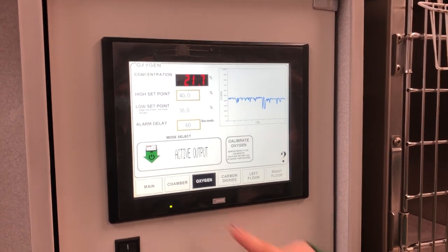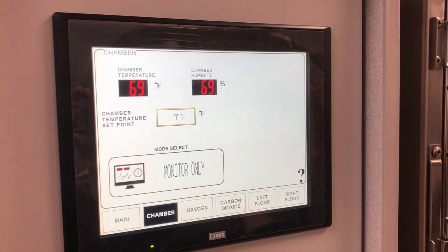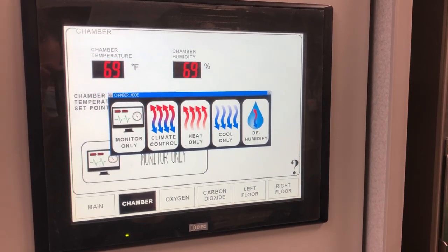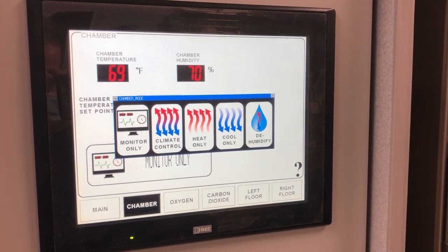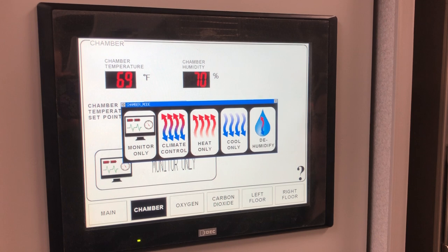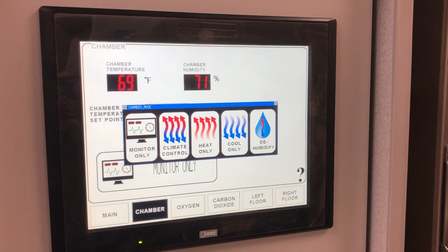Next, set up the chamber itself. Select chamber and set the temperature you would like — for example, 71 degrees — and it will automatically reach that. Select monitor only; there are four different options. Climate control will heat and cool the unit to maintain that temperature. Heat will only apply heat. Cool will only cool it down. Dehumidify — if the humidity is too high in the chamber, you have to select dehumidify manually; it will not do that automatically, and you also have to shut it off manually. Dehumidifying will also draw oxygen out of the chamber, using more oxygen, so it is not ideal to leave that setting on for long periods of time.